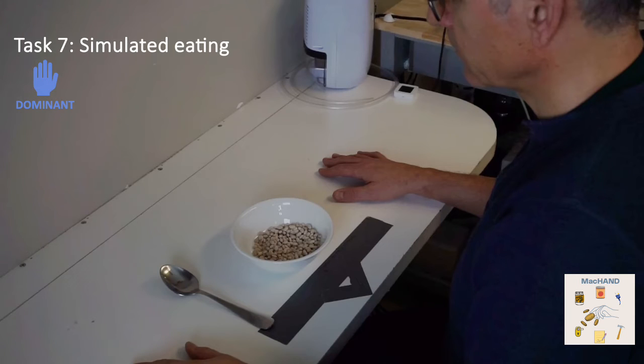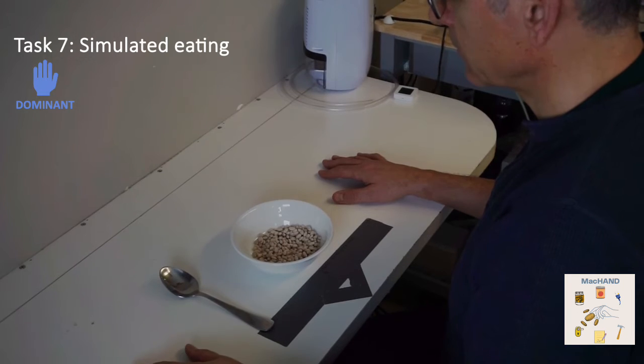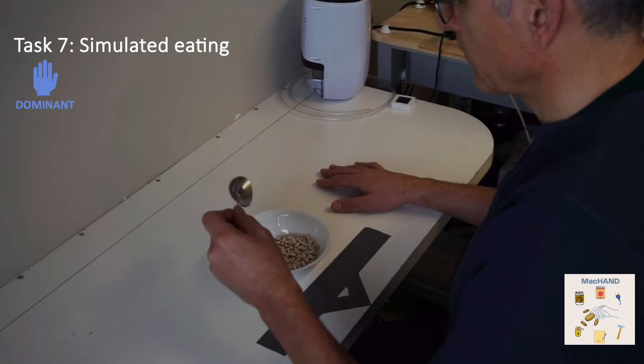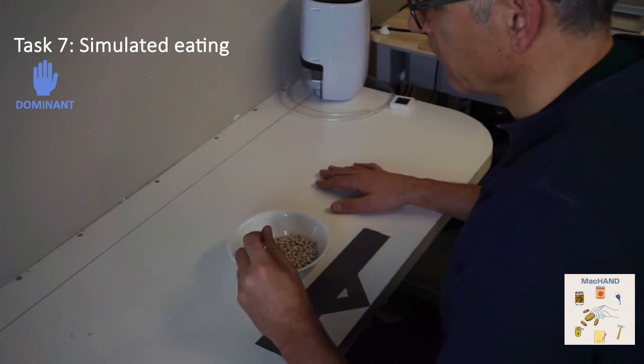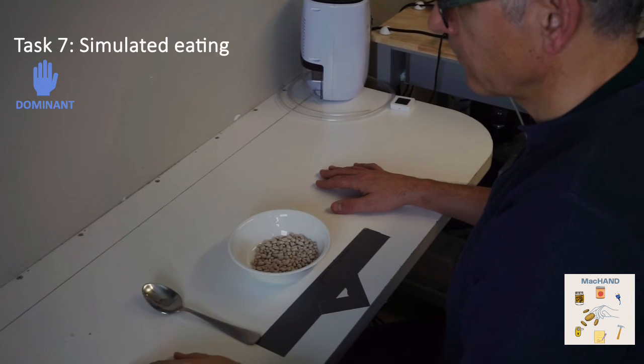Once again, in the MPA-S, task 7 is only completed if the tested hand is the dominant hand. So task 7 asks the patient to scoop up about 10 navy beans using a soup spoon and bring them near their face as if they were to take a bite and to put them back in the bowl. The assessor's focus is on lateral pinch, supination, and elbow flexion extension. If some beans are dropped, points are only deducted if it is a majority of the spoon's contents.